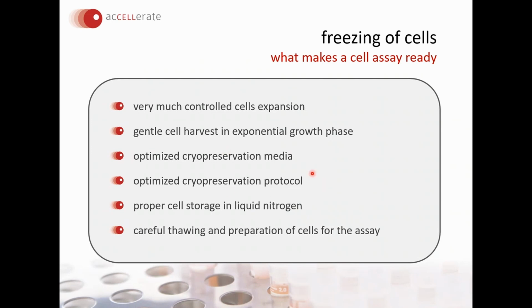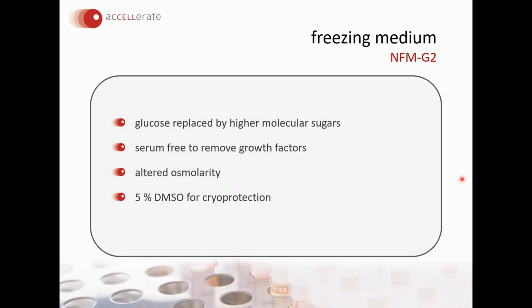Coming to these two most critical points of cryopreservation media and protocol, this is an example which we use for quite a number of projects, not for all. As I said, there is no one fits all, but we have developed a serum-free freezing medium with the rationale that we remove the serum to get rid of any growth factors to avoid any conflicting signals while the cells are frozen.